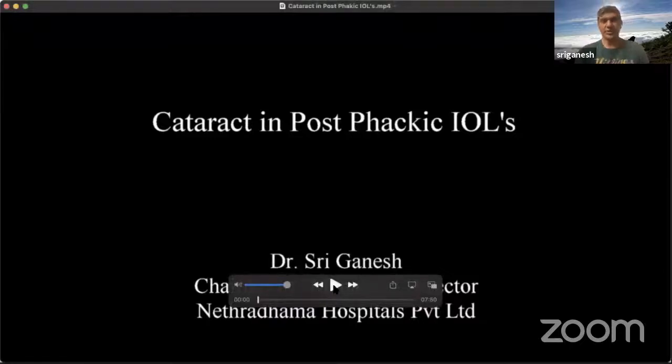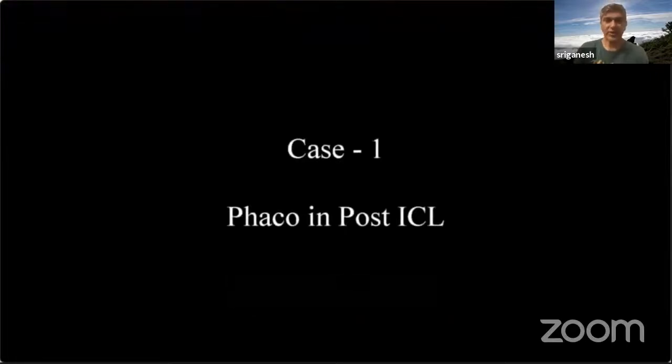So I'll just show you 3 cases. If you look at the etiology and incidence, which are the patients who are more prone? ICLs more than 15 diopters are more prone for cataract, age over 45 years, and a low vault, vault less than 100 microns. So I will show you 3 cases of cataract in post-ICL situation and how I manage them. I have no financial interest.